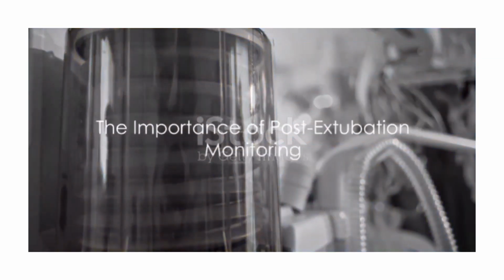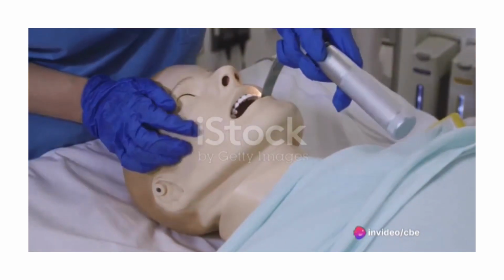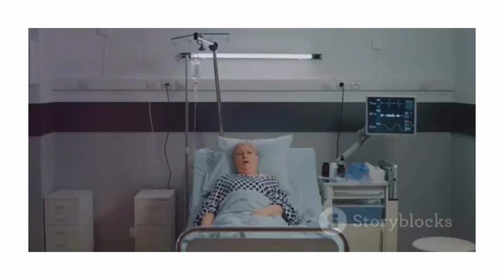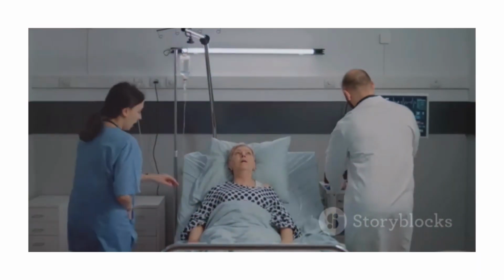So, to summarize, extubation is a vital process in a patient's recovery from respiratory failure. It involves careful evaluation, preparation, the actual act of removing the breathing tube, and post-extubation monitoring. Each step requires skill, precision, and a patient-centered approach.